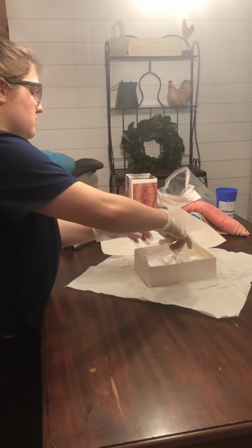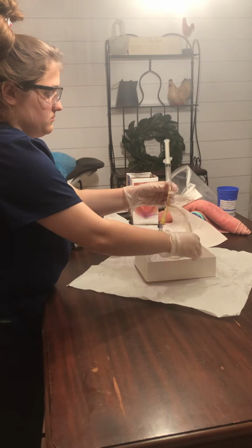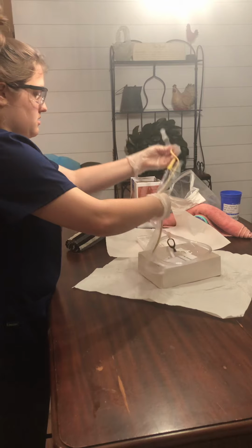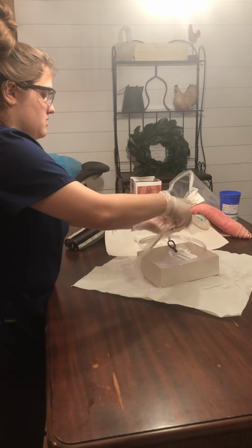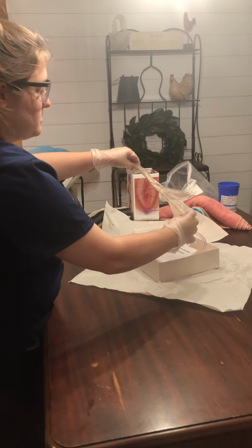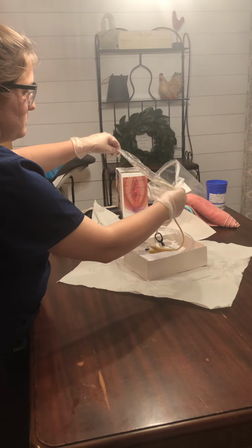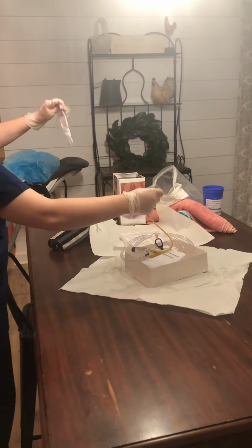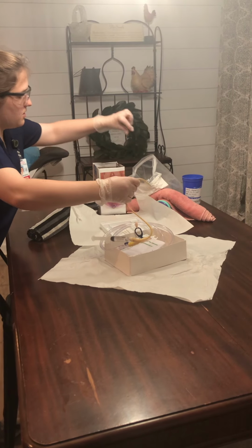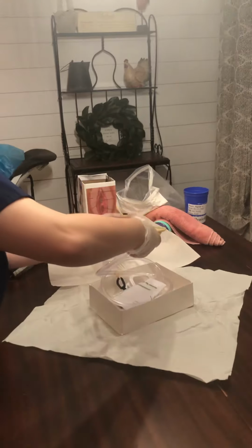So now I'm going to adjust my tubing. I'm going to take the plastic off of this, ball that up, throw it away, and then lay it in my lubricant.